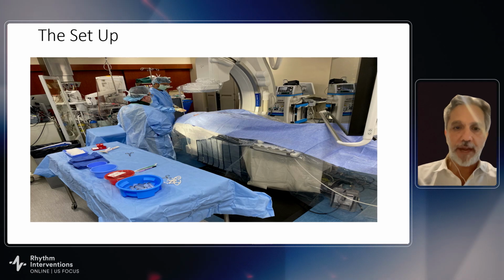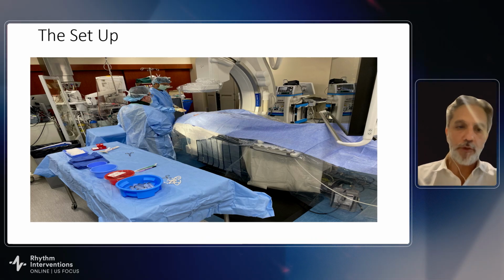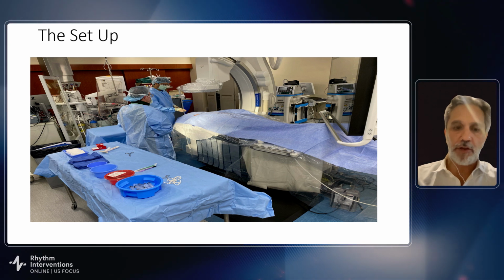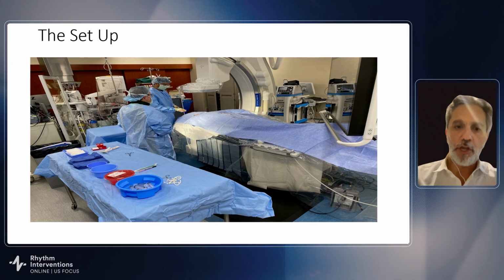So this is the setup. You see how we tilt the camera sideways to allow free movement around the head area. We usually use a small table here and a large table here, or you can just use one table and put it perpendicular to the X-ray table.